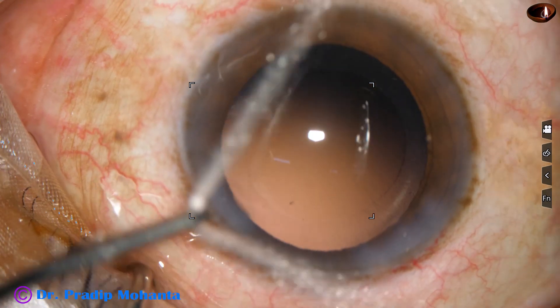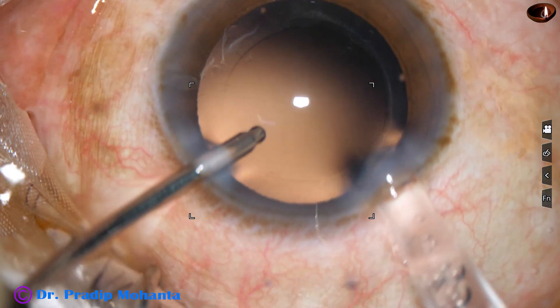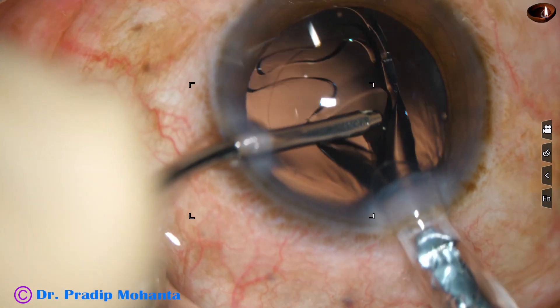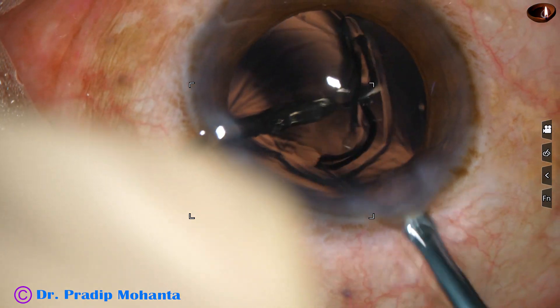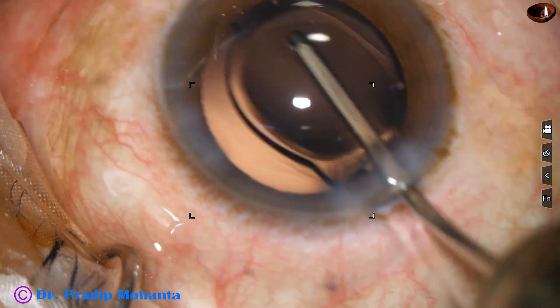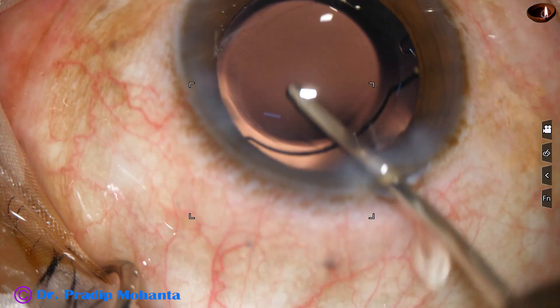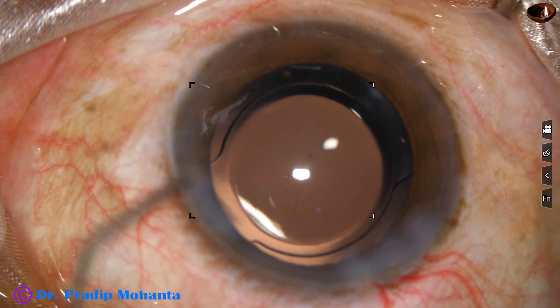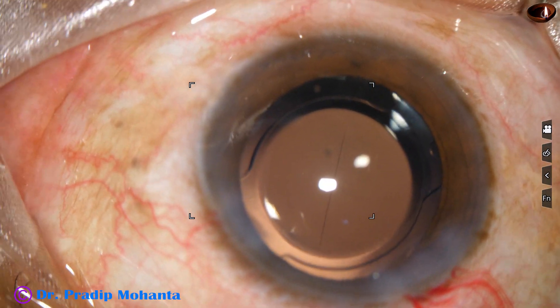Now this is hydro implantation. The irrigating probe maintains the anterior chamber and an intraocular lens is placed in the capsular bag. This technique can be used for toric IOLs where you do not have to use any visco, and you can minimize the risk of rotation of the toric intraocular lens. In this case the lens is in the capsular bag.